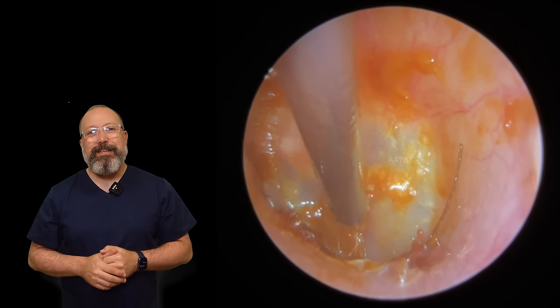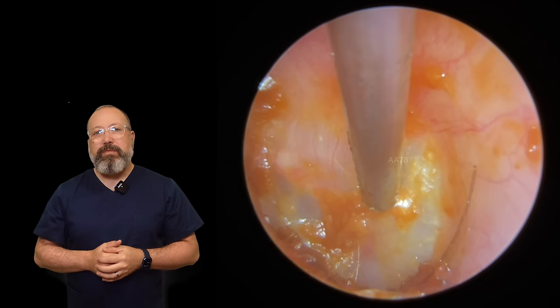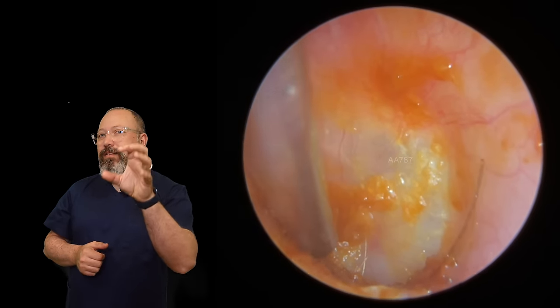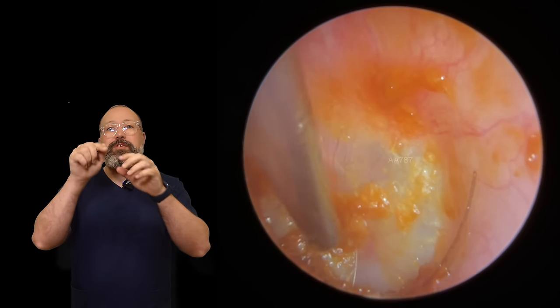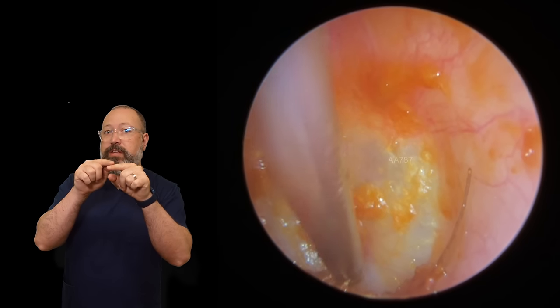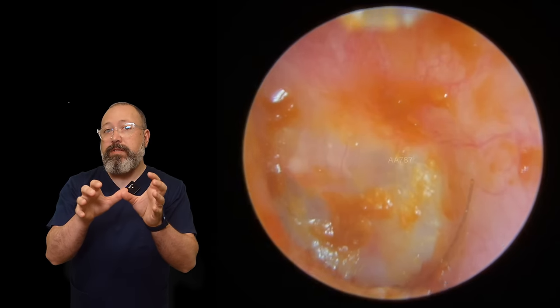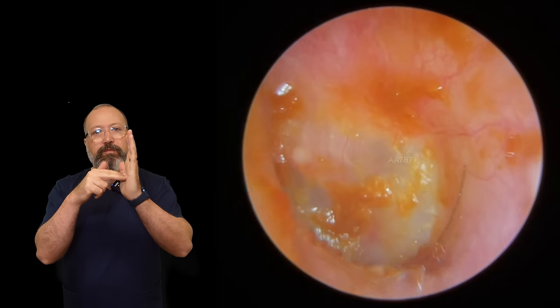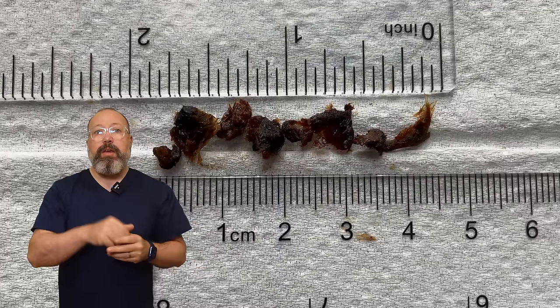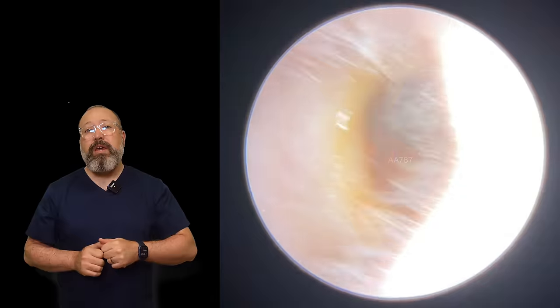Very slowly working our way along, just trying to take these tiny pieces off and get as much off the drum as possible. You saw that little flinch — that jerk in the camera — because we accidentally touched the anterior recess ridge with the side of the fine end and the patient flinched. This is why you have to be so careful clearing the eardrum, and why we leave some bits behind sometimes. If the patient flinches while the suction tube is on the eardrum it might catch it. So it's left for patient comfort and safety.